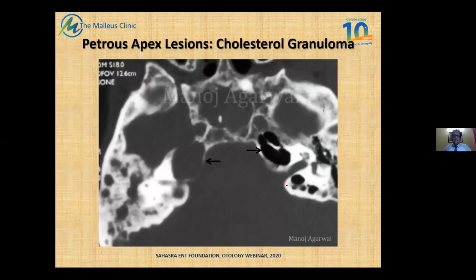Okay. Now, typical lesions. This is a petrous apex, an aerated petrous apex, and this is a petrous apex with an isointense, unilobular, smooth shadow, and you can see that there's a lot of effusion into the mastoid antrum. So this is a petrous apex granuloma. We will discuss the differential diagnosis of a granuloma, say from a petrous apicitis or a petrous apex tumor later on, maybe during the MRI discussion. But this is a petrous apex granuloma.